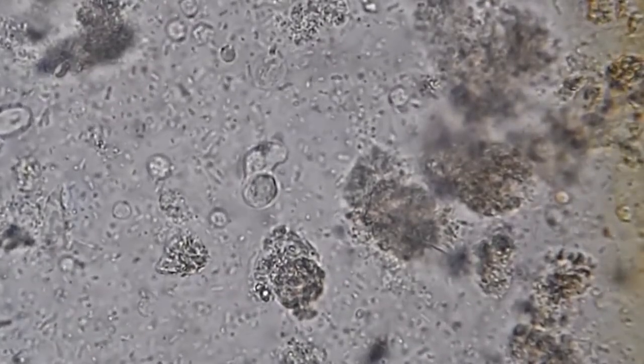That's very common. People who have protozoa infections tend to have multiple protozoa infections because they've been exposed to fecally contaminated food and water. So particularly in those who have come from developing countries, refugee camps, etc., you almost expect when you see one protozoa to see more. What I want to point out about that is when you're screening for protozoa, if you see one protozoa, don't stop and just report that. Keep looking because you'll find more.